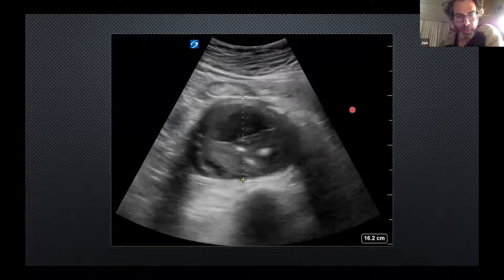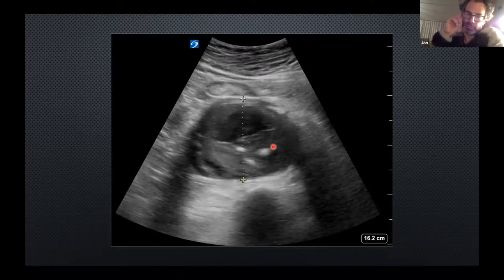And then the next part of the HIMAP is aorta. So here's a big chunky AAA. I think this measured at about 7 centimeters. We always measure from outer to outer wall, including the thrombus within the clot. So in terms of shock, if you see an AAA, it doesn't necessarily tell you it's ruptured, but if the patient's shocked and there's no other obvious cause of the shock, then the finding of an AAA would obviously make you very suspicious that it's a ruptured AAA.